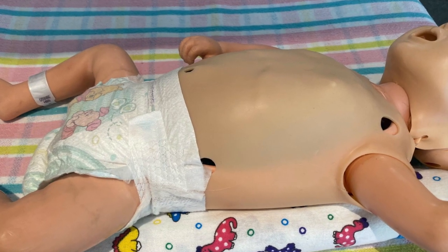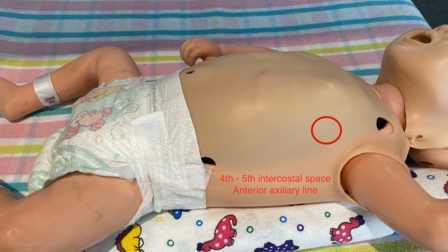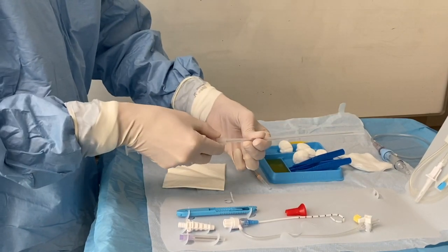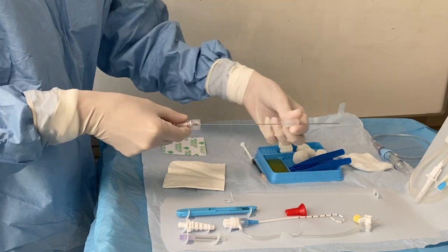The catheter will be inserted at the 4th or 5th intercostal space at the anterior axillary line. Assemble the intercostal catheter by removing the protective sheath and spacer.